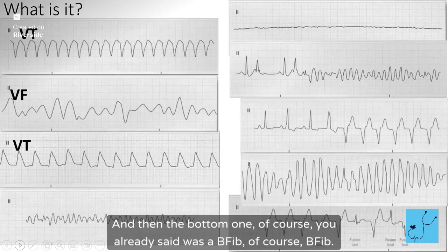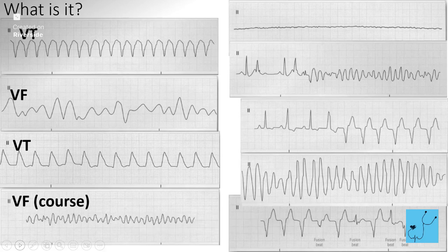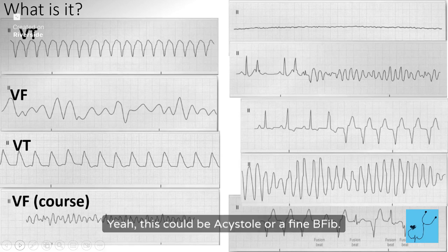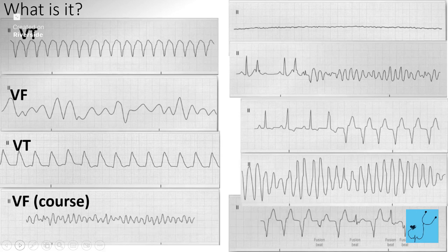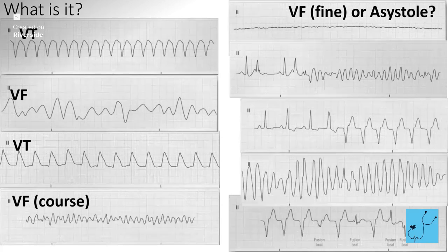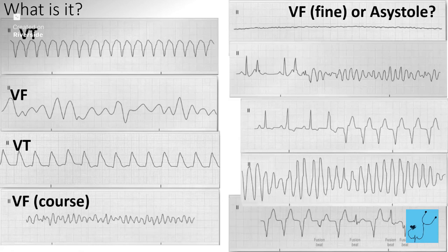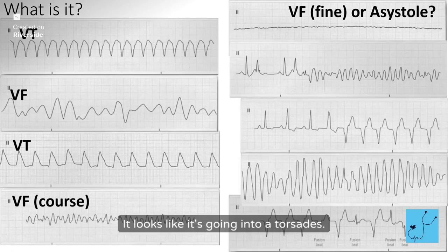And then the bottom one, of course, you already said was a VFib. What about that top one over there? Yeah, this could be asystole or a fine VFib. So we're probably going to shock that one either way. Either way, they have no pulse. What about this one? It looks like it's going into a torsades.